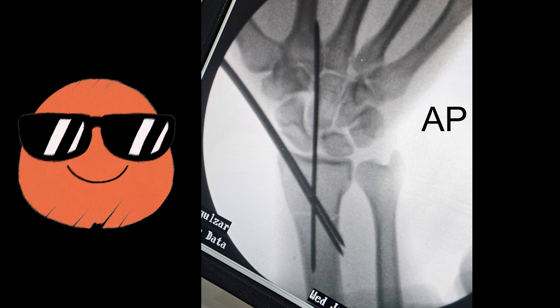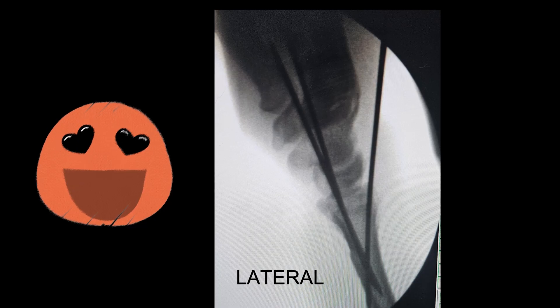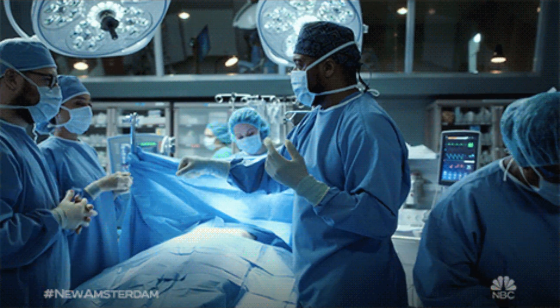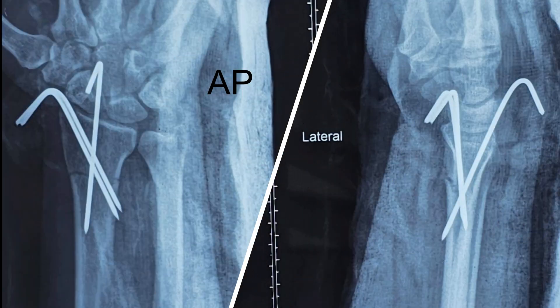Once the second cortex has been achieved, I'm taking the AP view — here you can see a nice reduction has been achieved. I'm also taking the lateral view, and here again in the lateral view, a beautiful reduction has been achieved. After this, the K-wires were bent and cut, dressing was done, and an above-elbow POP cast was given. These are the post-op X-rays of the same patient — you can see the AP and lateral views showing good K-wire fixation achieved across the fracture site.